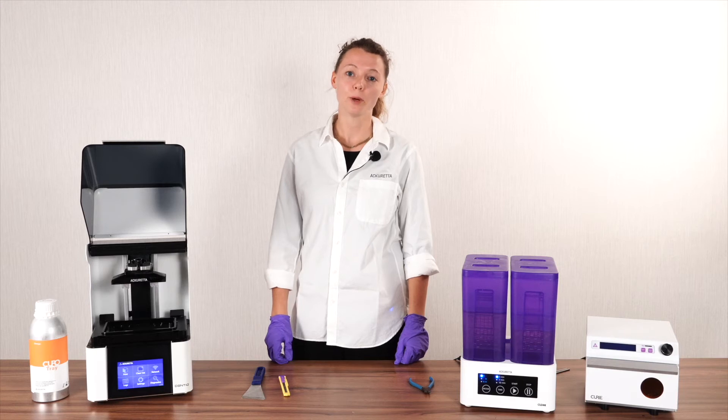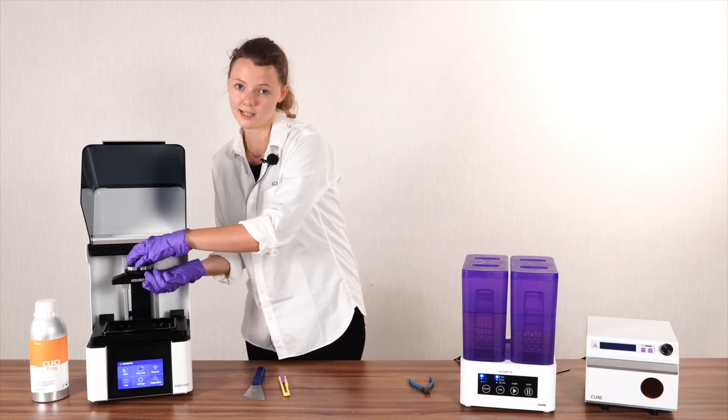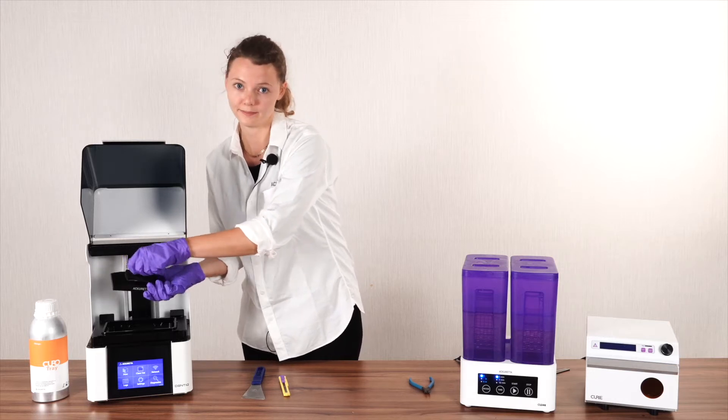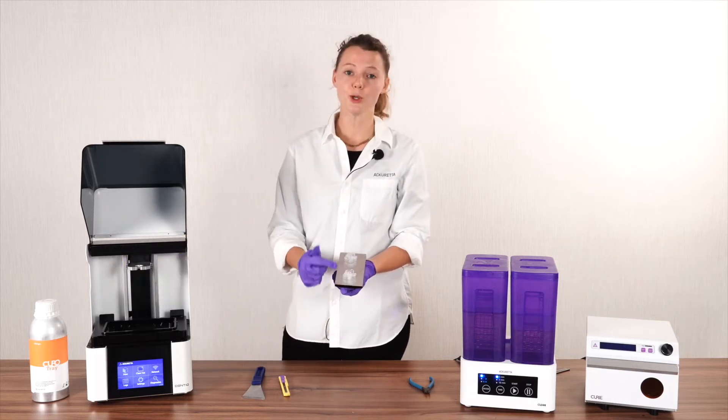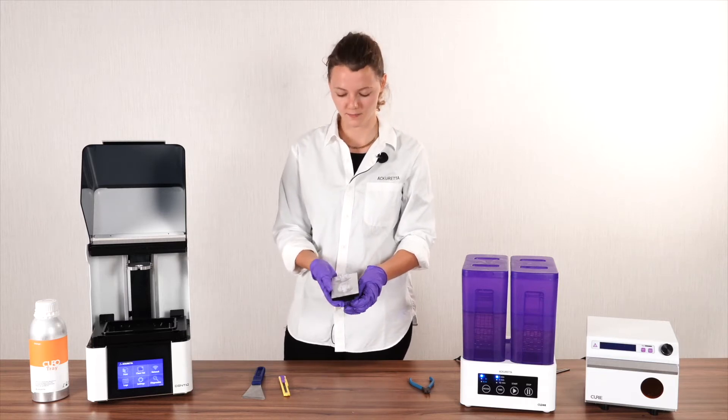Your 3D print is done, but your job isn't over yet. Post-processing is actually one of the most essential steps in 3D printing — it ensures the accuracy of your print and also the health of your patients.